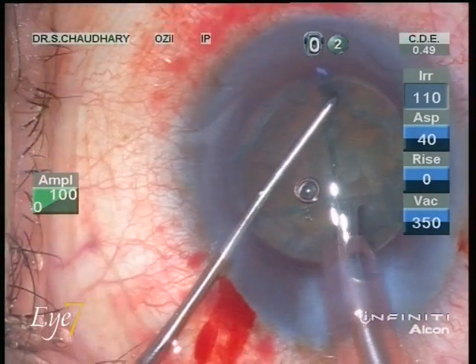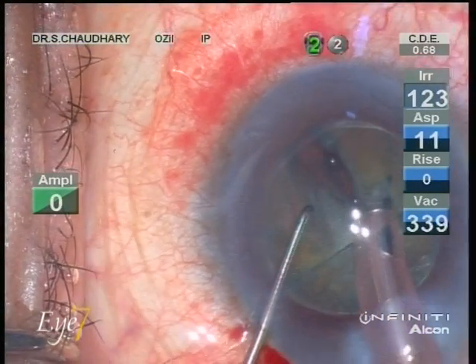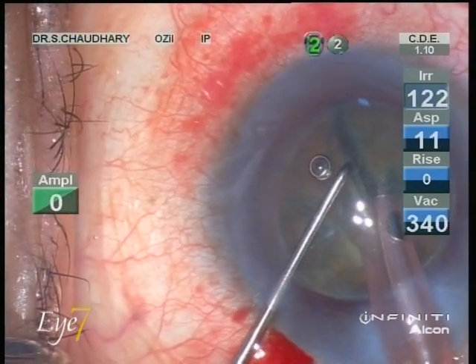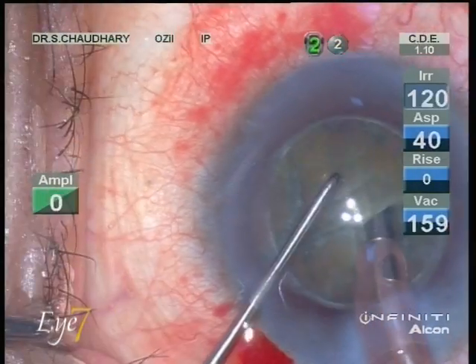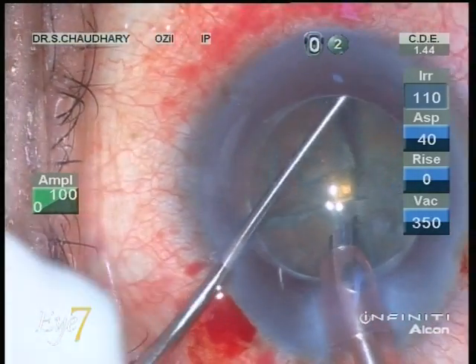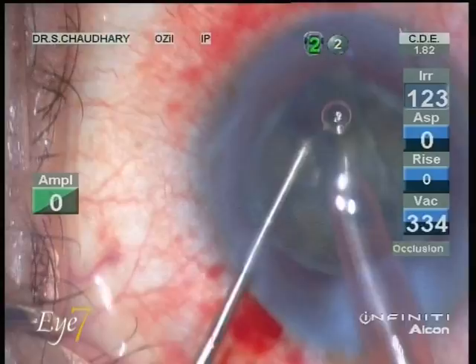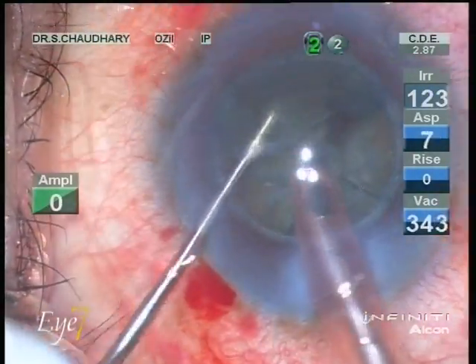With phaco, we first open up the pre-cut parts of the nucleus, which has already been cut into four pieces. We are hardly using any phaco energy here — we are actually saving on phaco energy which we would have used normally to make these incisions. This helps us reduce our effective phaco time and the cumulative dissipated energy. Once we have these four incisions opened out, like any normal phaco procedure, we pick up each nuclear fragment, break it up into small pieces, and suck it out.